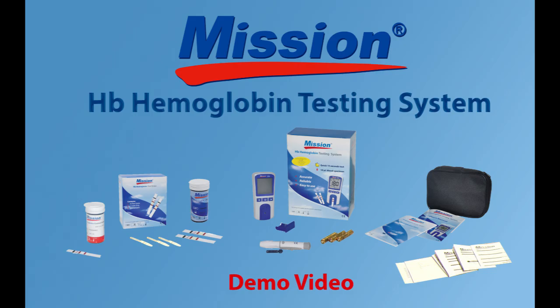Welcome and thank you for choosing the Mission HB hemoglobin testing system. This system is intended for the quantitative determination of hemoglobin and calculated hematocrit in capillary and venous whole blood.